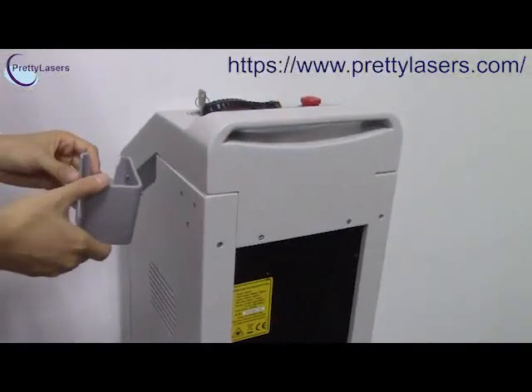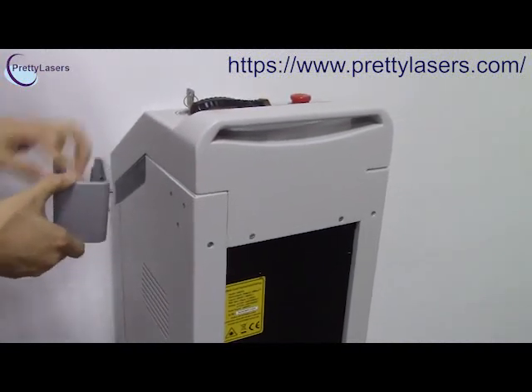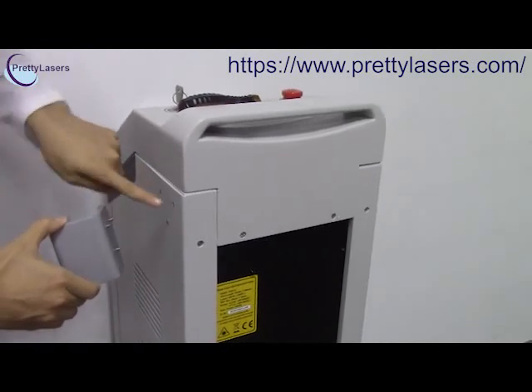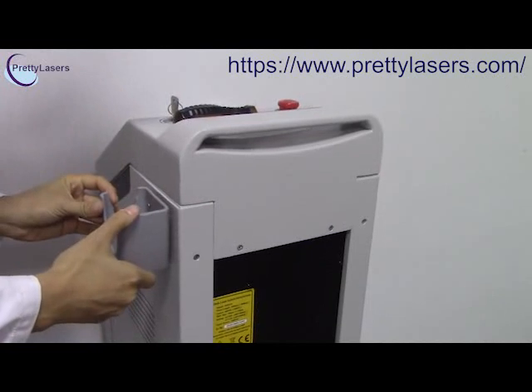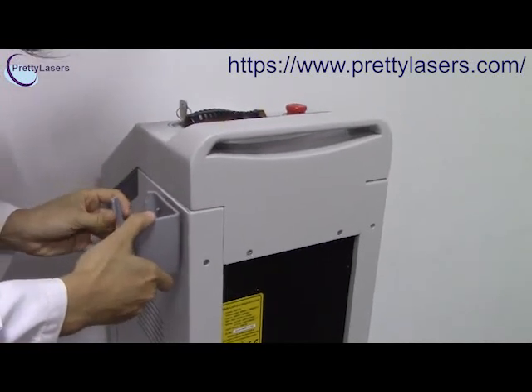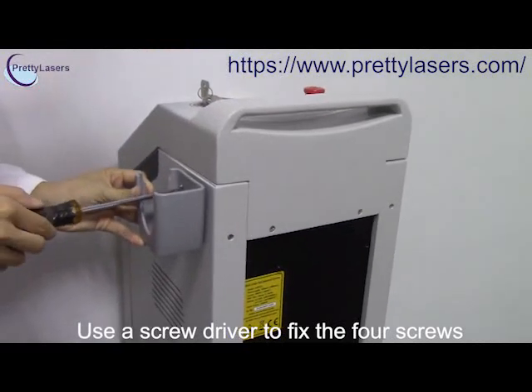Now we install the shelf. Before installation, we have to match the position — the screw matches the hole — and then insert, and use the tool to tie it.